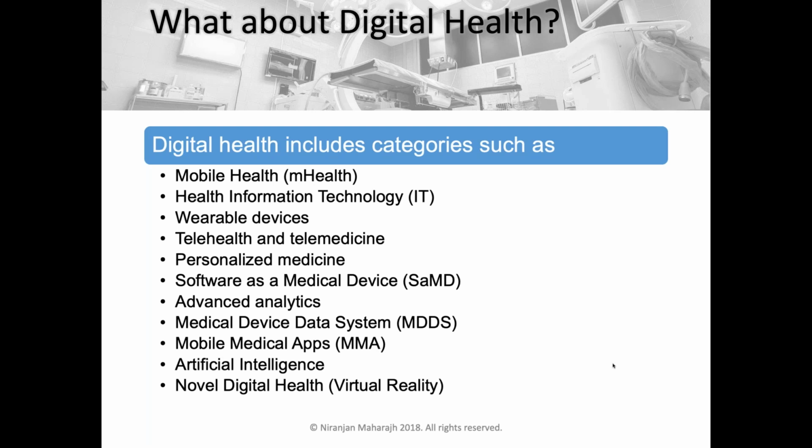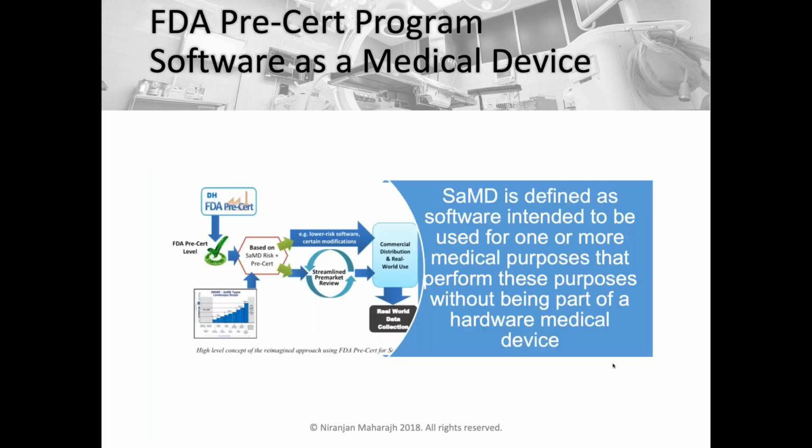And there are regulations around mobile health and mobile medical apps. We'll talk a little bit about the Apple Watch in a second, but that's one area where the Apple Watch as a medical device was released under mobile medical apps. So this whole area of digital health is driving its own set of guidances and regulations.